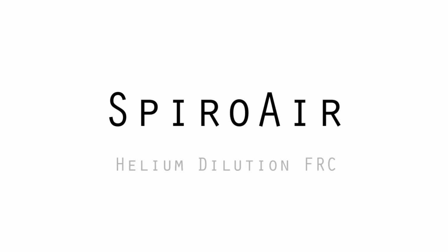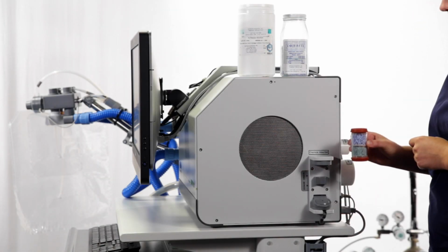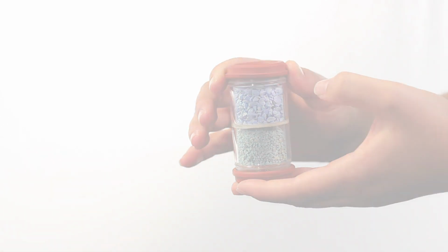SpiroAir, performing helium FRC. We recommend that the technician glance at the small chemical absorber before starting a test to check the status of the dryerite.